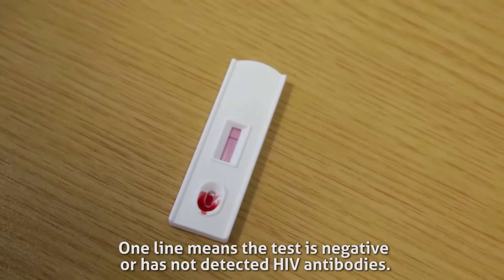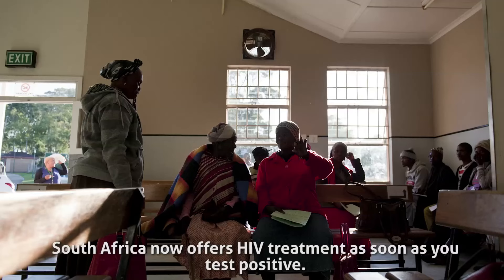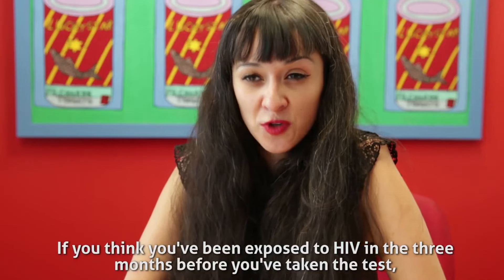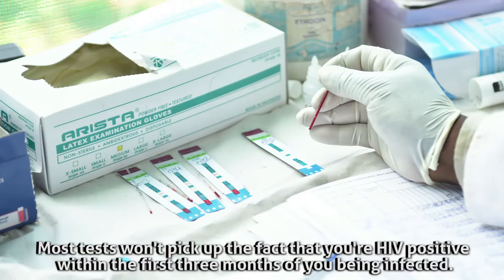One line means the test is negative, or has not detected HIV antibodies. Two lines mean that the test is positive, and you should go to your nearest clinic for a confirmatory test. South Africa now offers HIV treatment as soon as you test positive. If you think you've been exposed to HIV in the three months before you've taken the test, you should take another test in three months just to make sure. Most tests won't pick up the fact that you're HIV positive within the first three months of being infected.